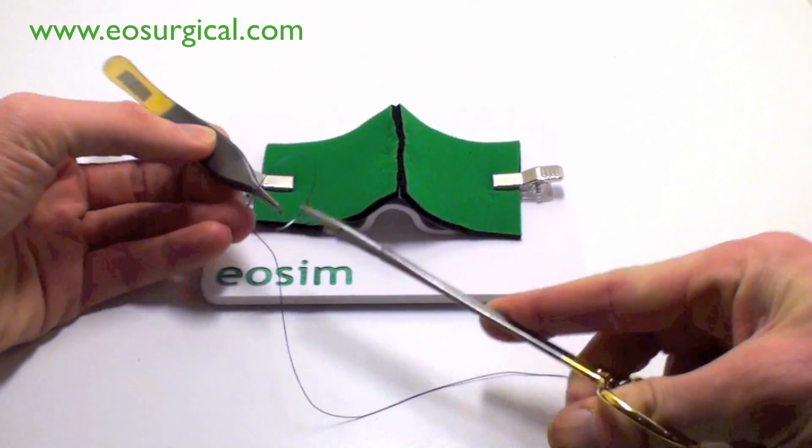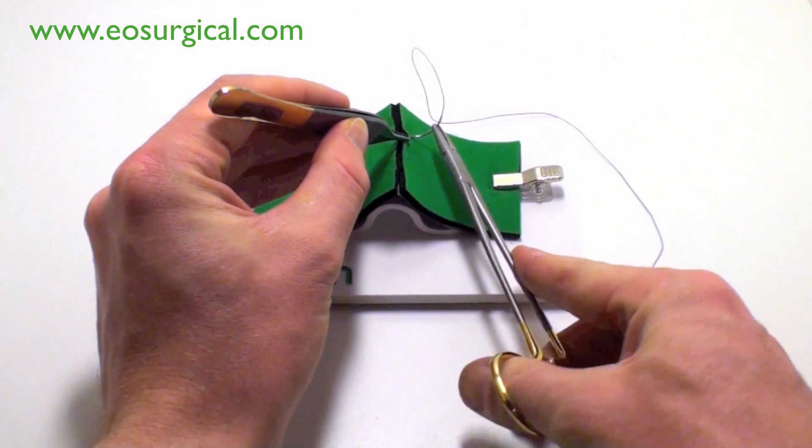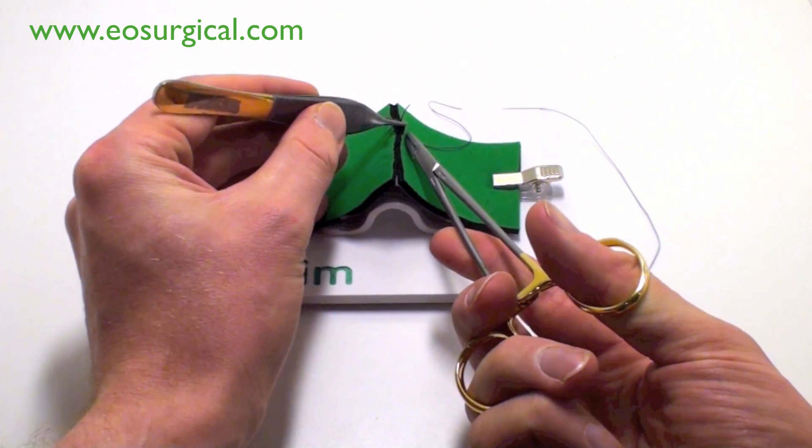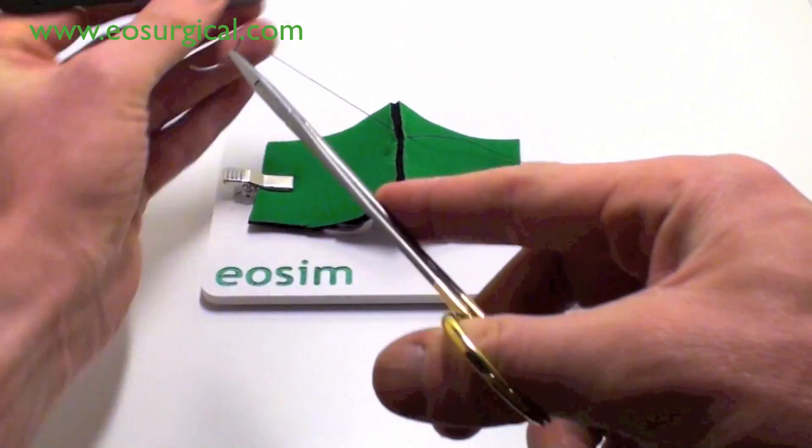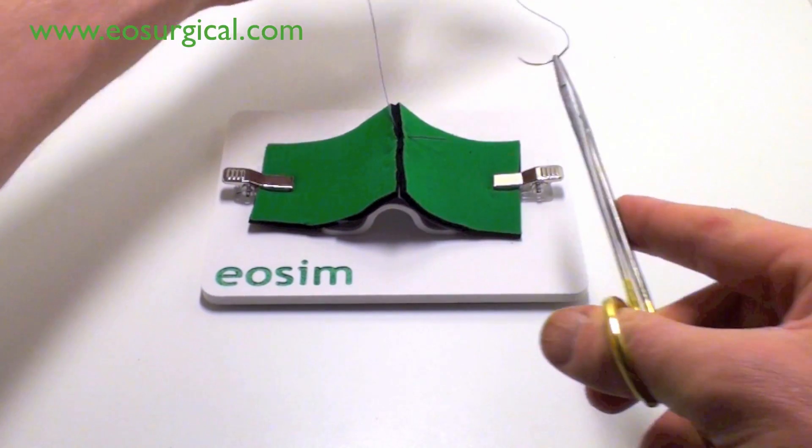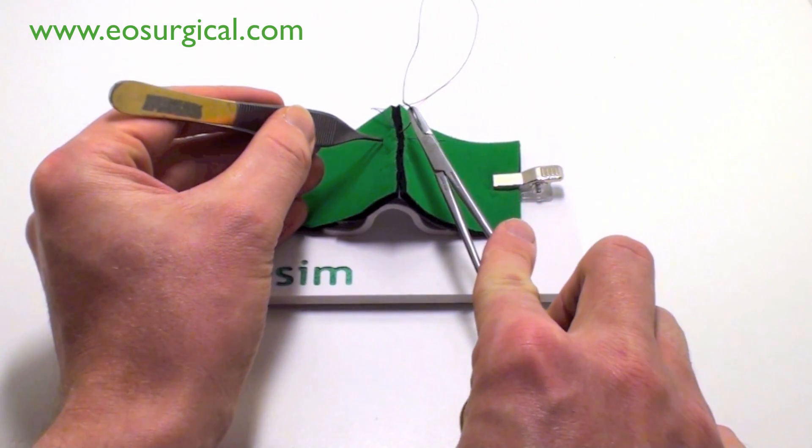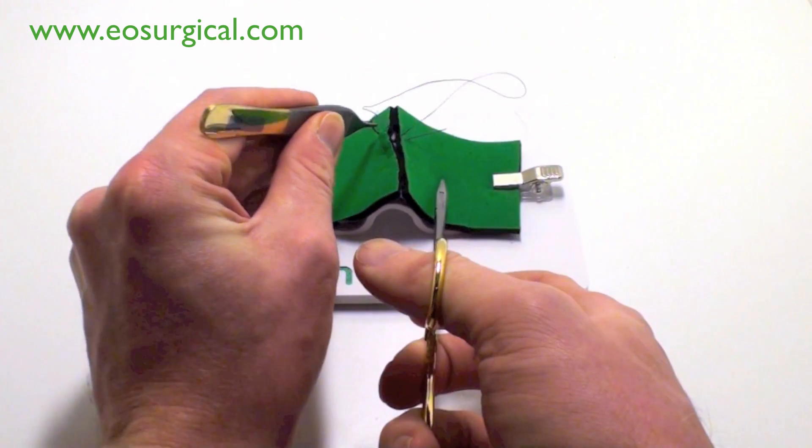Now, let's look at this from a more expanded point of view. This will show you what the surgeon's hands are doing. Again, note how the wrist is rotating to allow the suture and needle to curve through the tissues. And again here.